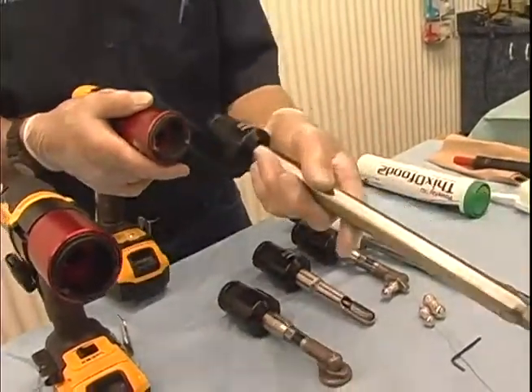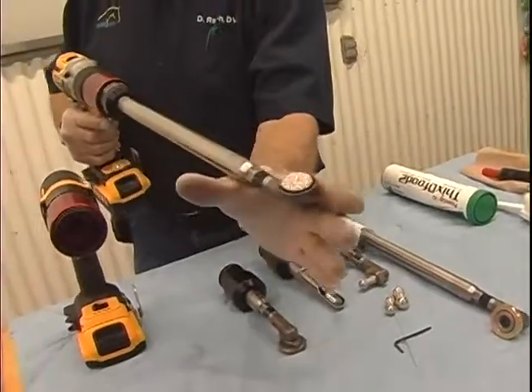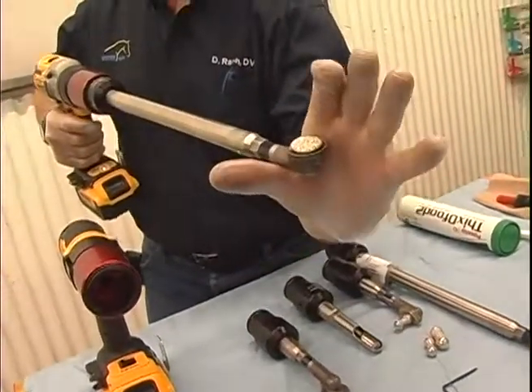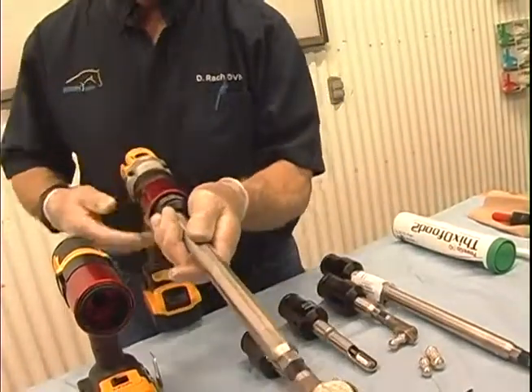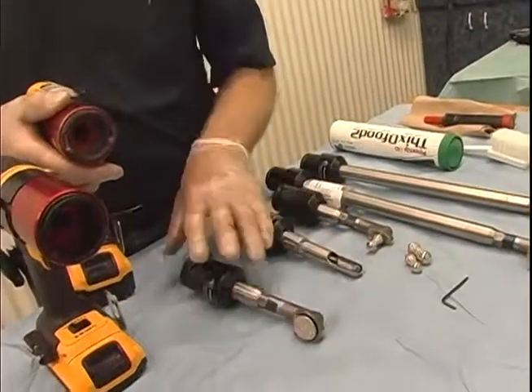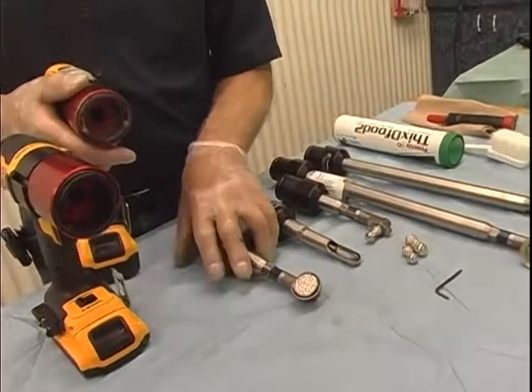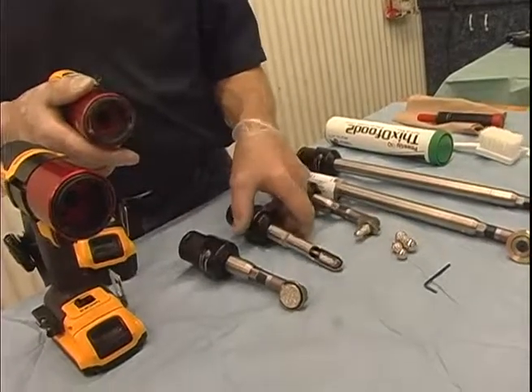Personally, I use the long shaft on incisors, and I just use my arm longer, and I support it like this when I'm working on incisors. So this is a specialized tool, generally for people who have a shoulder or elbow problem.